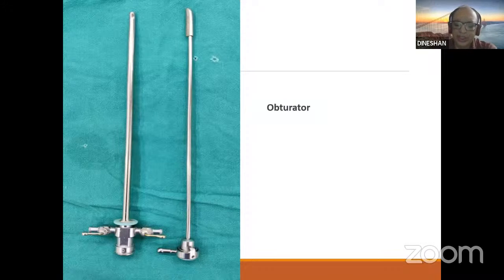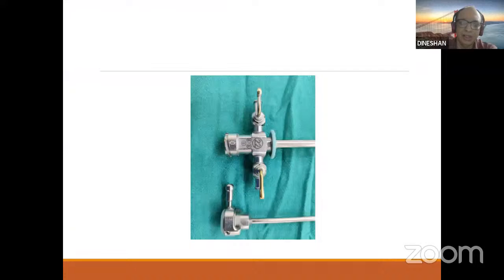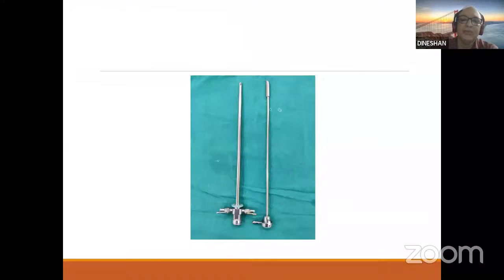The reason why you need the obturator is the beak of the sheath, which is curved slightly dorsally and is smooth. If you pass it blindly without the obturator, there is a chance that it may injure the urethra. So you have to pass it with the obturator.